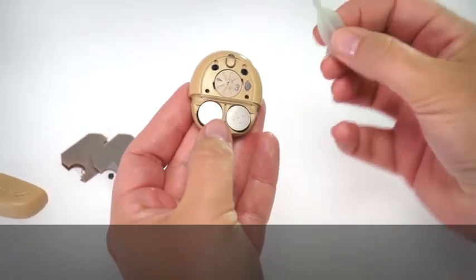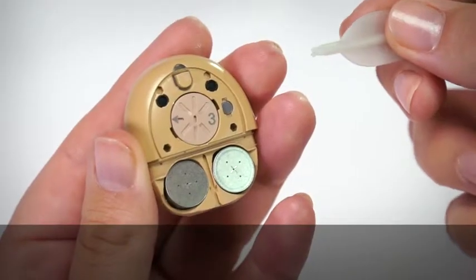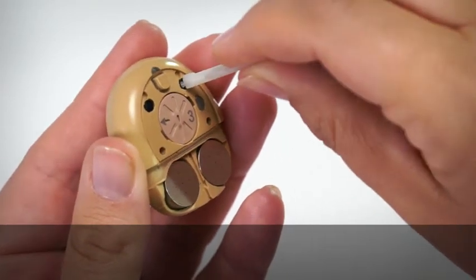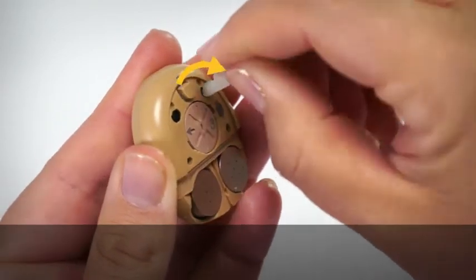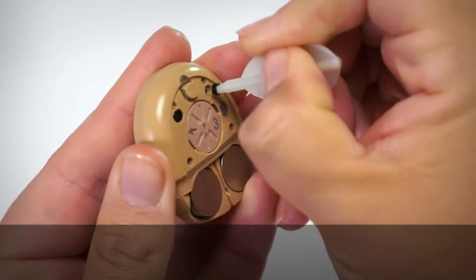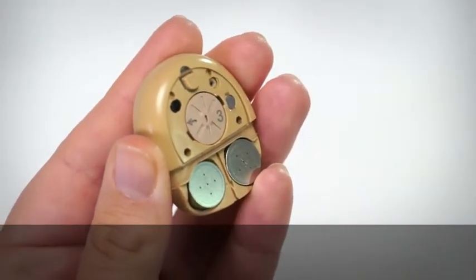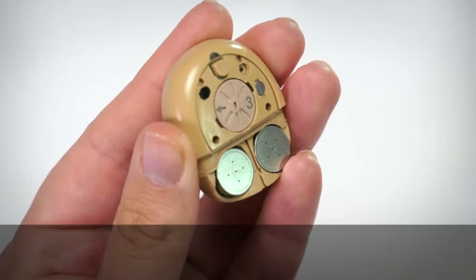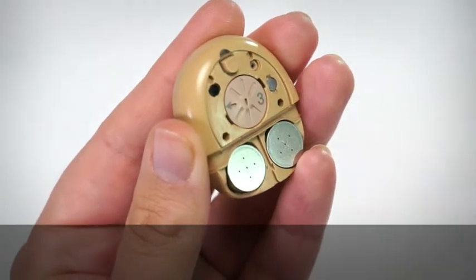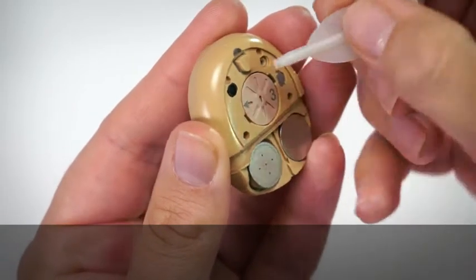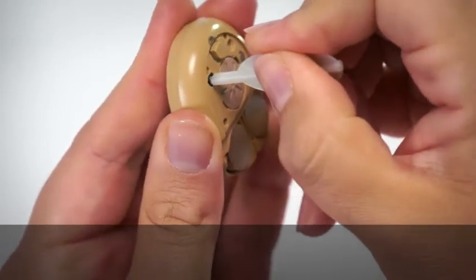Firmly push the tip of the removal tool into the middle of the microphone protector. Turn the tool 90 degrees clockwise and lift out the used microphone protector. Pull the used microphone protector from the tool and discard. Remove the other microphone protector in the same way.